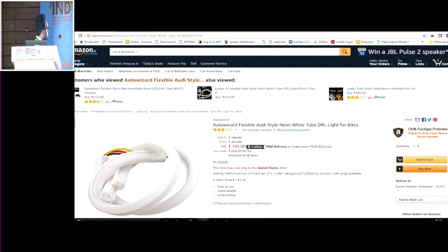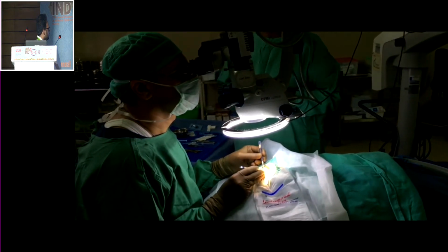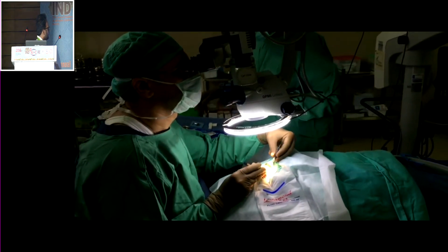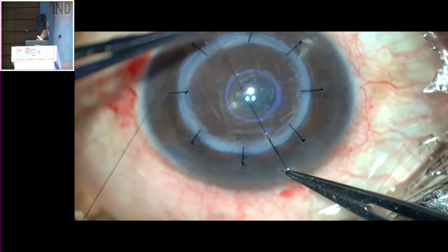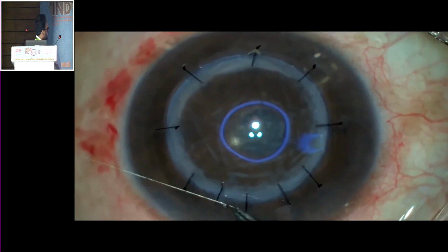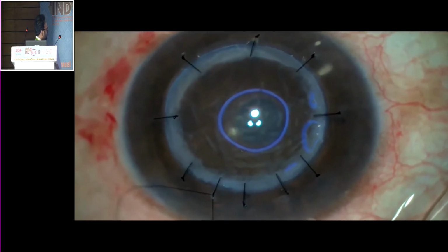We went online and bought a simple flexible LED strip and had our biomedical engineer attach it to our microscope. The device does not cause obstruction in the surgical field. It provides ring illumination with white light, avoiding distracting shadows. A circular mire is obtained by tightening the sutures at the long axis of the oval. Here, the oval mire suggests that a tight suture is required at 1 o'clock. As the suture is tightened at 1 o'clock, the oval mire becomes circular.